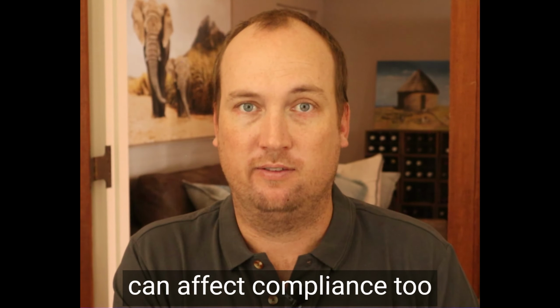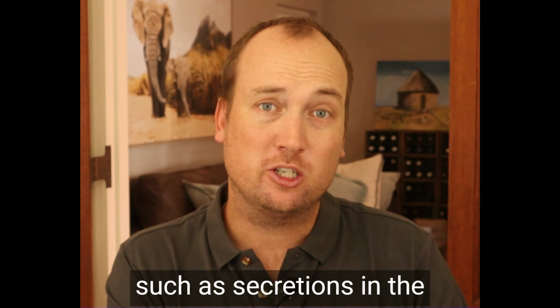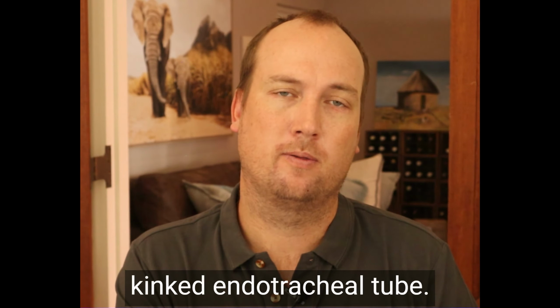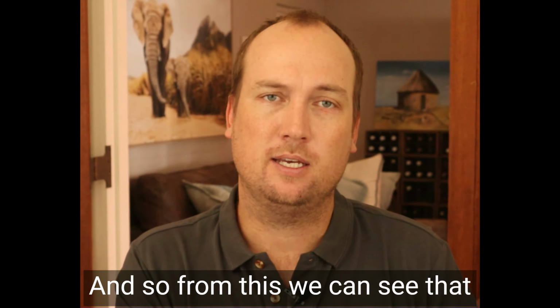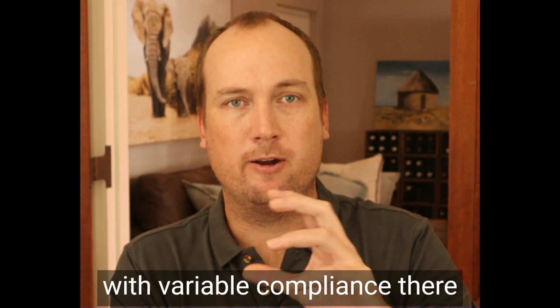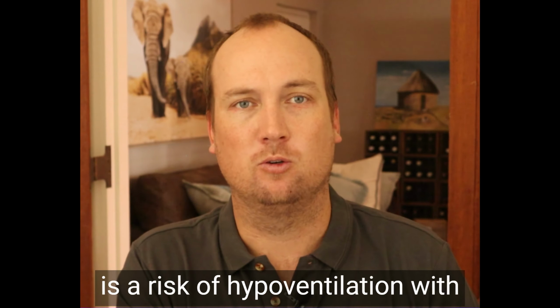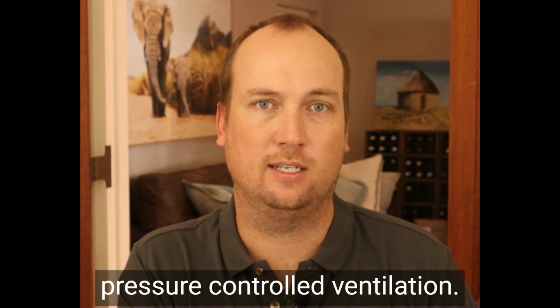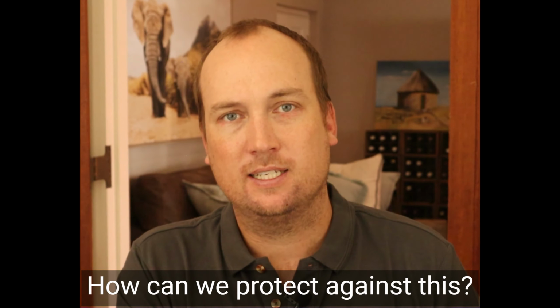There are other things that can affect compliance too, such as secretions in the endotracheal tube or a kinked endotracheal tube. And so from this we can see that with variable compliance, there is a risk of hypoventilation with pressure-controlled ventilation. How can we protect against this?